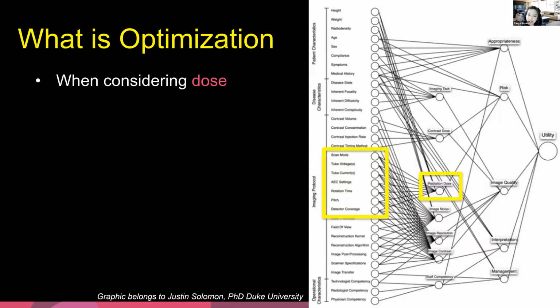This is a good point, because I didn't know about this before. I wondered why image quality is so poor in the lower C5 or so, but I didn't know it was because we need to scan from the bottom up. Yeah, I know next week is the body, so I'll actually include a couple of slides and show you what it means to go from the bottom up versus the top down. And I'll show a couple of examples of a sagittal C spine. So this can help with the CT cervical spine and also CT soft tissue neck. Definitely. Yes.